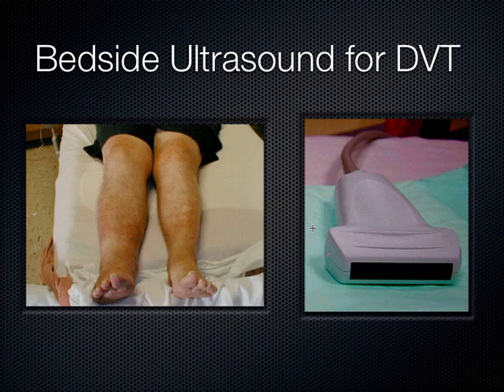What we use is the linear transducer. The linear transducer in these cases, of course, it's sometimes referred to, some people call this a vascular probe, but we can use it for so many more things than just blood vessels. And what's the biggest blood vessel in the body? The aorta. It's a deeper structure.